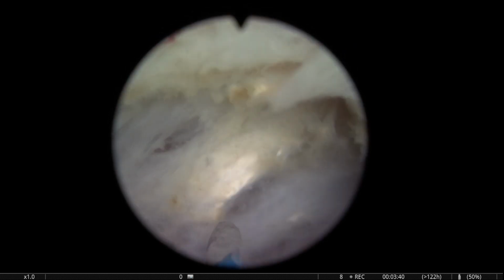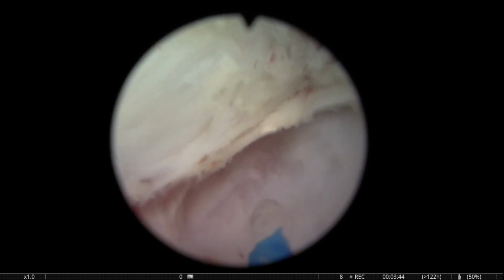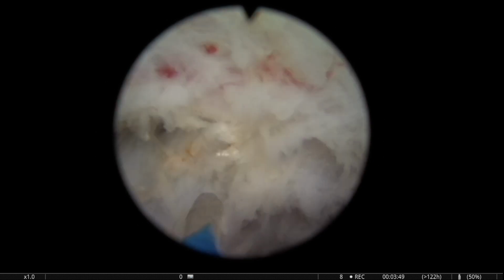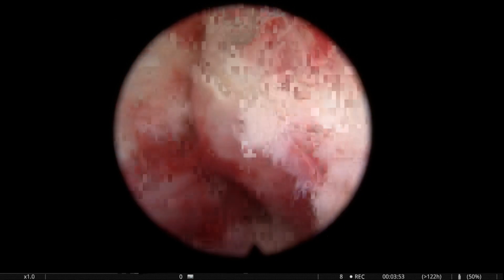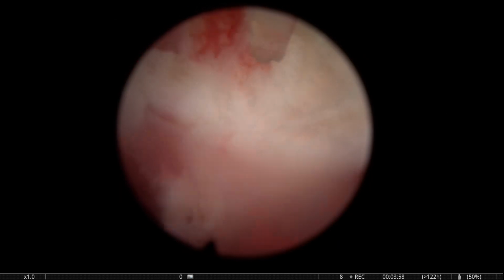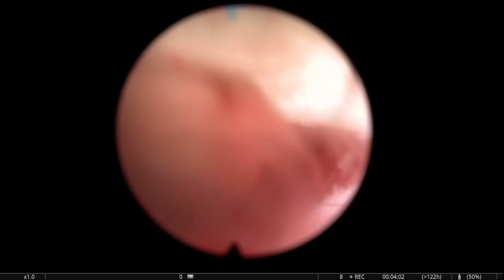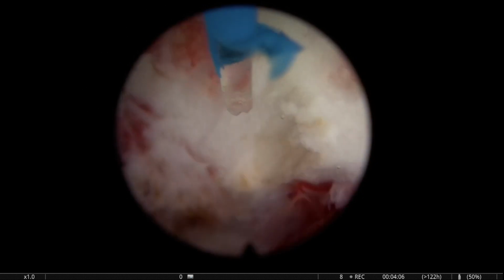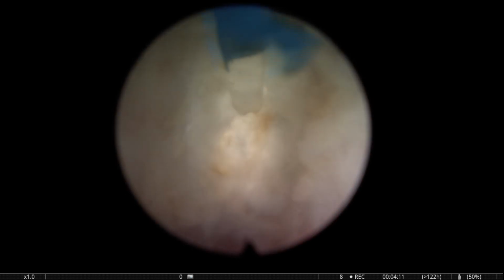Here you see I'm not looking anymore for a beautiful plane, because I think it's very painful when you try to recognize a beautiful plane. It's very painful because not always you can find a beautiful plane, and not always you can keep seeing it, because with these newer generation lasers, even if you are in the beautiful plane, most of the times the energy is going to obliterate this beautiful aspect of the plane.